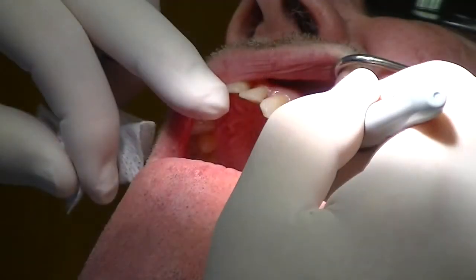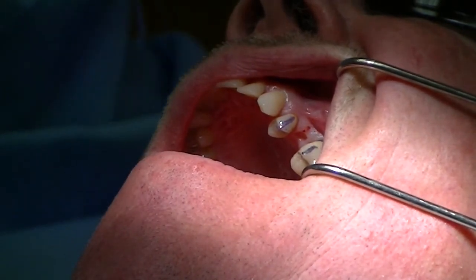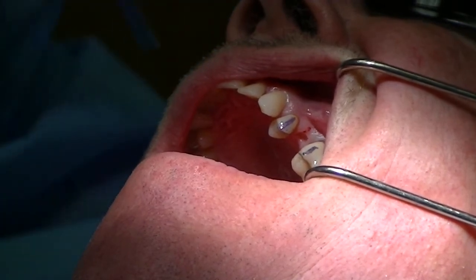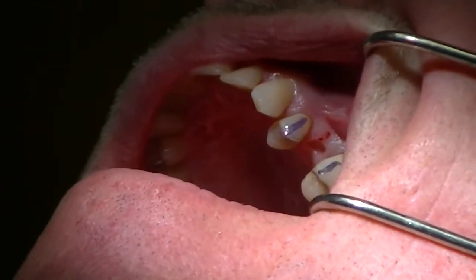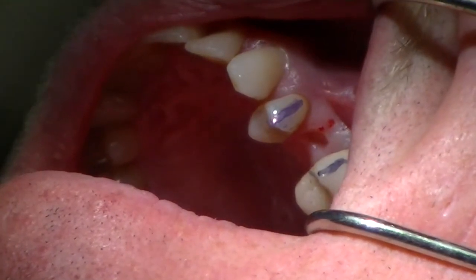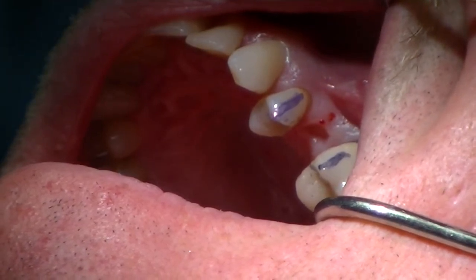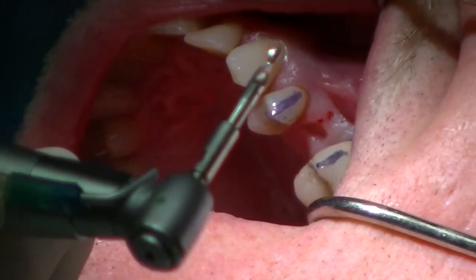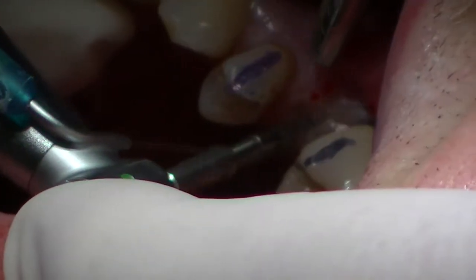I've actually marked the facial aspect of the adjacent teeth. This simply gives me field goalposts to look at to help me angle mesial-distally correctly. Buccal-palatally, we want to place the implant basically in the center of the central groove area. I do use a marker a lot to help me in determining the correct position of the dental implant. After anesthesia of the soft tissue, I will simply take my 2.4 diameter burr, line up the field goal, and simply penetrate through at 800 RPMs just to establish depth.